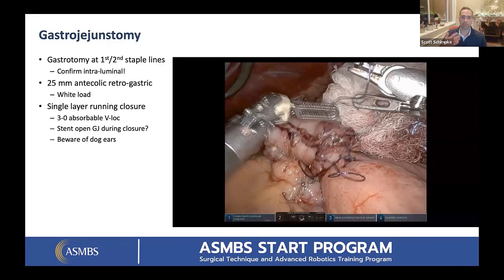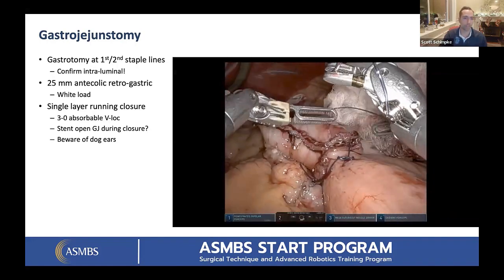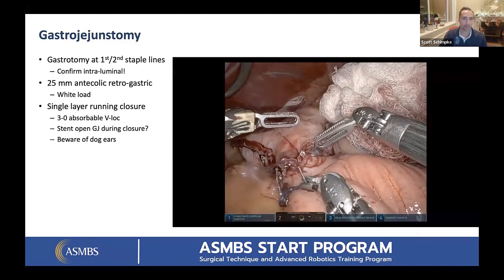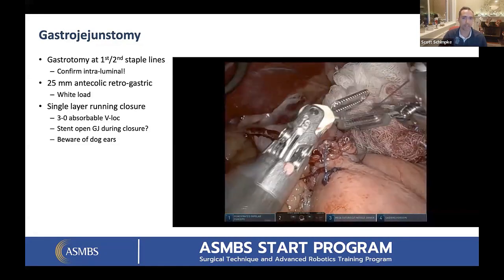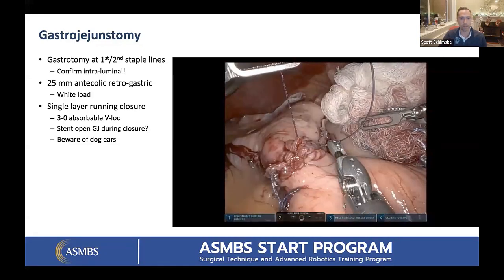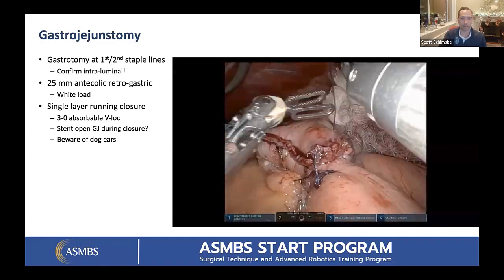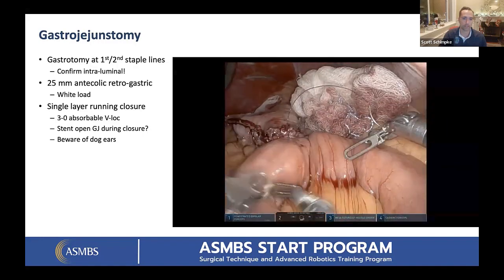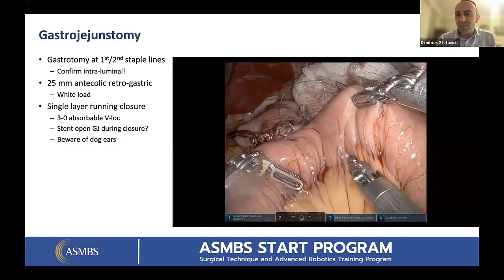Some surgeons use bougies or an endoscope or some sort of tube to stent open the anastomosis. That's a perfectly acceptable way, obviously, to make sure you minimize back-walling. I don't use anything, again, going to that theme. That's just my preference, but that's an option too. You can stick an endoscope or whatever you want to use down there just to make sure. I used to use the scope or a bougie until a couple of fellows sewed it in, and then I stopped using it.